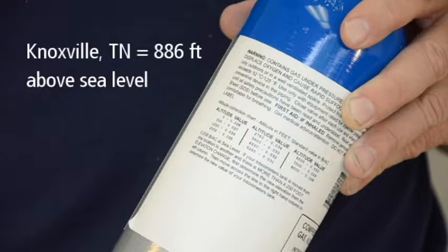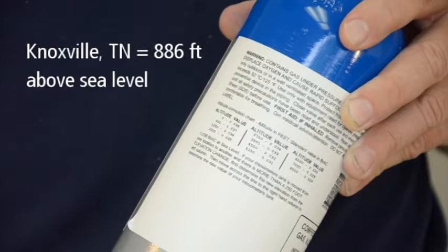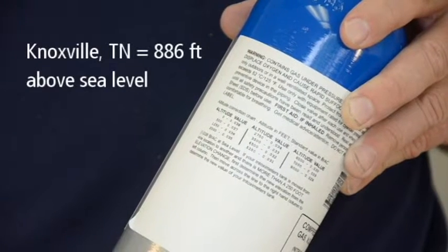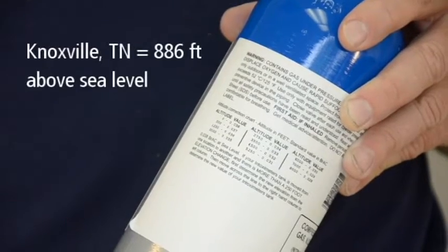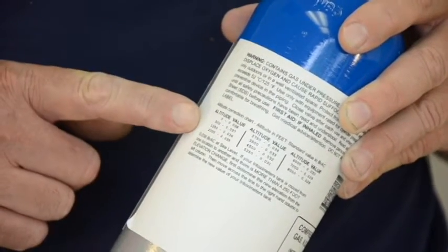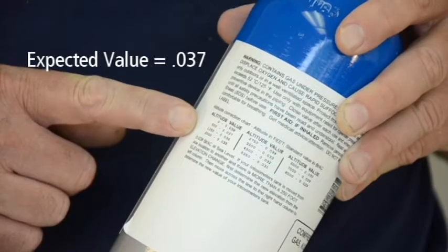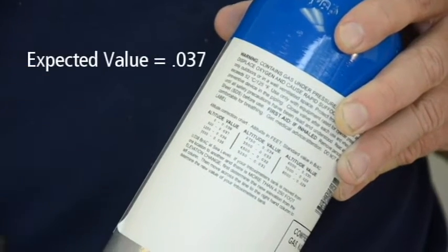For example, if you are performing an accuracy check in Knoxville, Tennessee, which has an altitude of 886 feet above sea level, the altitude chart shows the expected value of the alcohol gas tank to be .037.